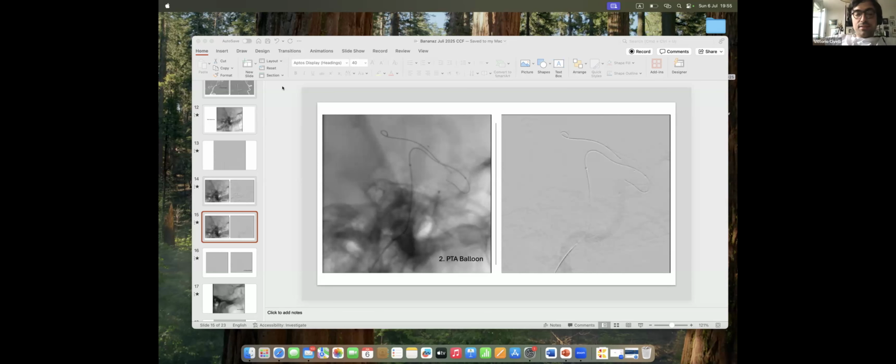In terms of patency of the stent in the long term, I have this notion that maybe there is a tendency to close after a while in quite a high number of cases. Maybe it's a wrong notion. Maybe you and Maxime have experience in this field, because if it stays open, it's a very, very elegant solution.